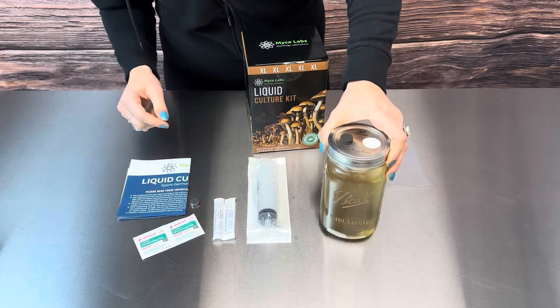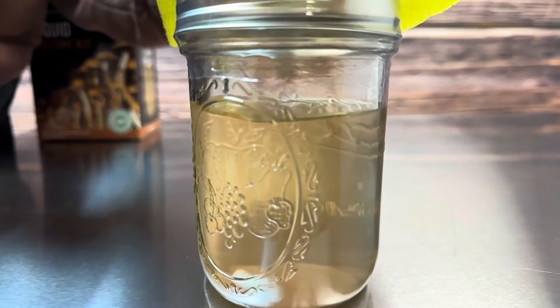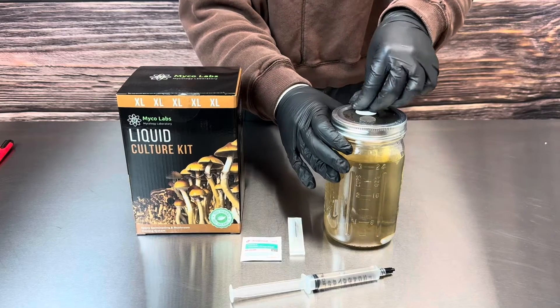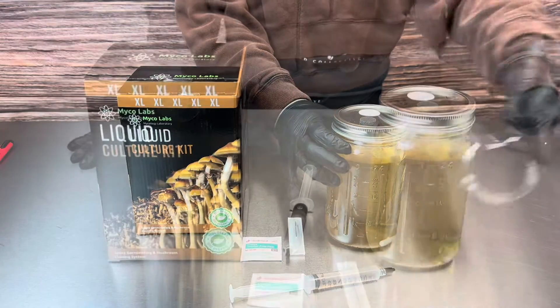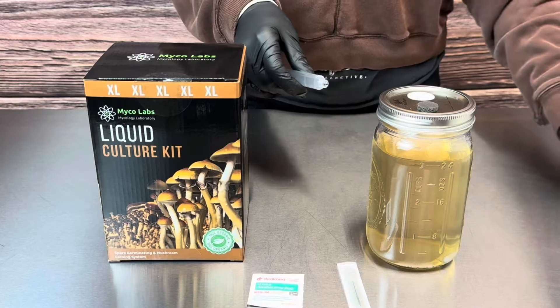Once you've finished unboxing, look for the white stir bar — sometimes during shipping it gets stuck to the lid, so just hit the lid and it should fall out fine. It's best to inject spores and start the process as soon as possible; best results are achieved when used within two to three weeks after receiving. Once colonized, the culture can be stored in the fridge for three months.